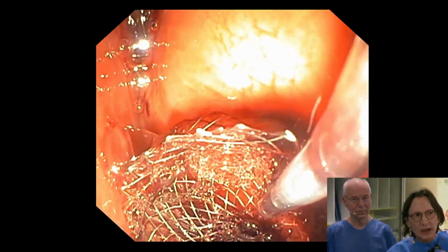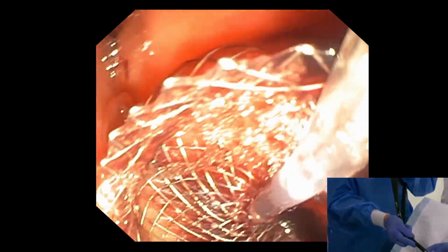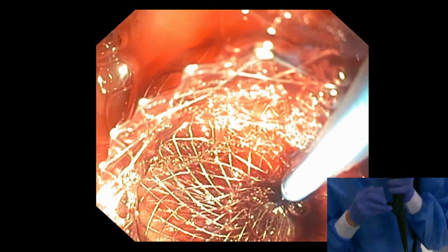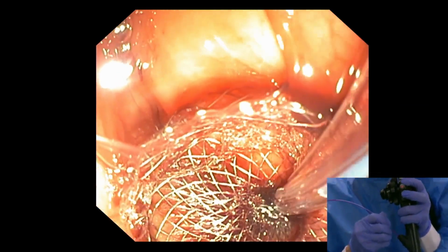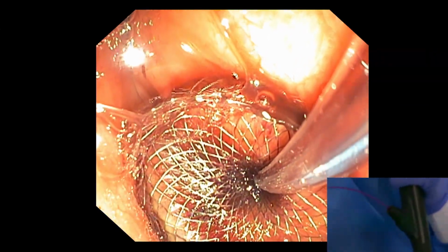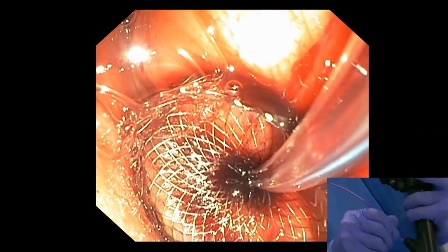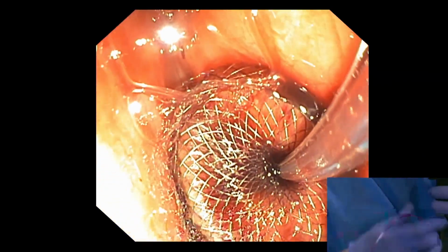Now, you have two options. You do have a wire inside of this. So if you're coming at an angle, you can advance the wire out. So let's just try that with the wire first. There, it goes in nicely. I'm going to follow the wire. Okay, I'm pushing in. So remember, you don't want to risk dislodging the LAMS. So that's why I'm being so careful. So I'm just going to push in a distance, and then I'm going to start to back off.